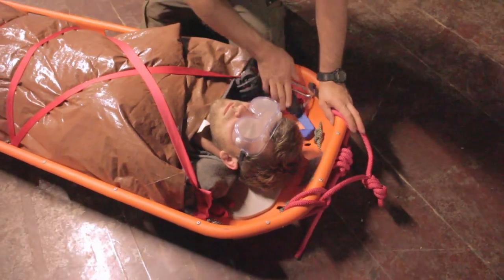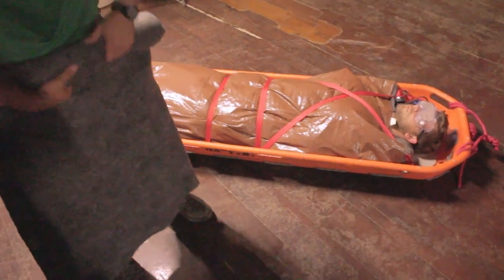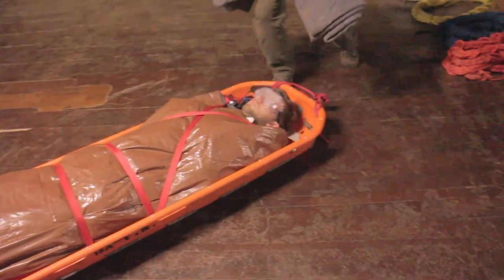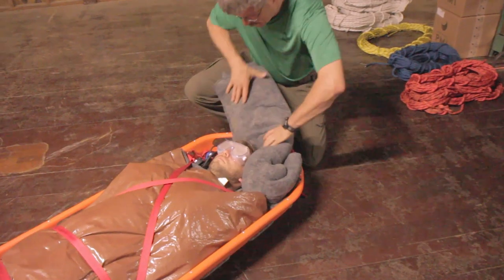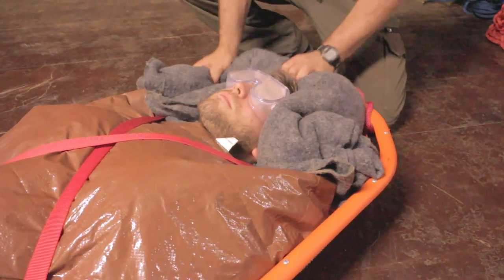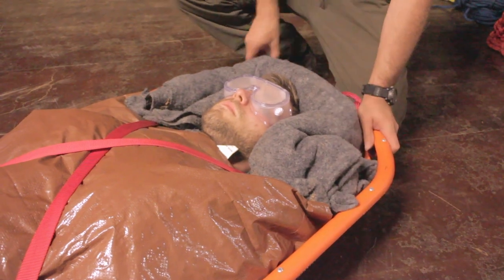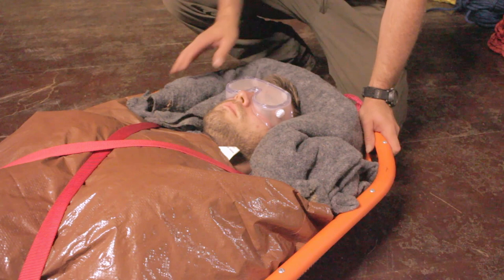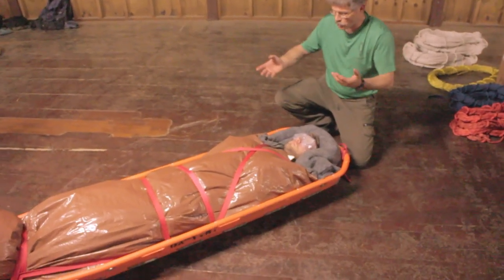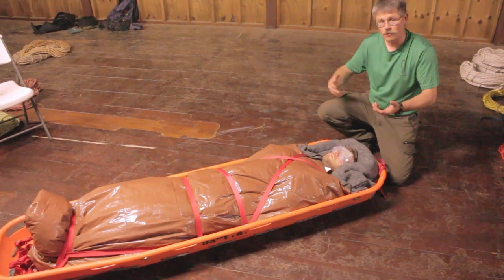Eric is well secured. At this point, the only thing that remains is if we wanted to provide some extra insulation around Eric's head. We can grab one more blanket, make a long blanket roll, and fill the void above Eric's head with some blanket to kind of nestle him in. We can secure that with duct tape coming across — we're taping the blanket in place, not taping the blanket to our patient's head. That concludes the packaging in the Ferno for a patient with moderate injuries or medical condition. There were no special considerations made here for long bone injuries, rib injuries, or pelvic injuries — we have modifications to the system for those, and those will appear in future videos.